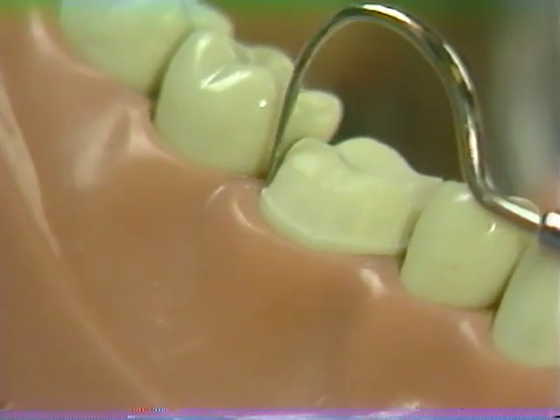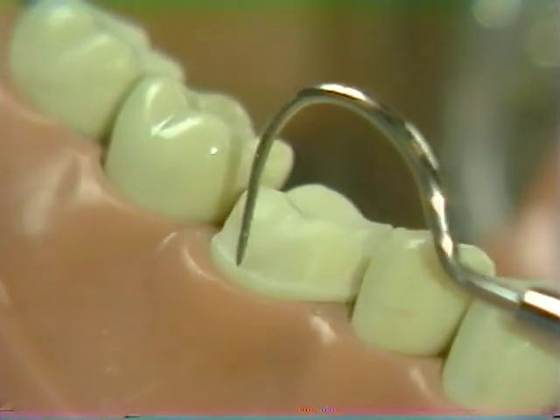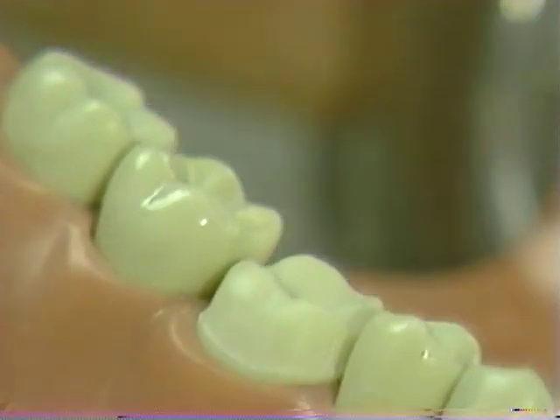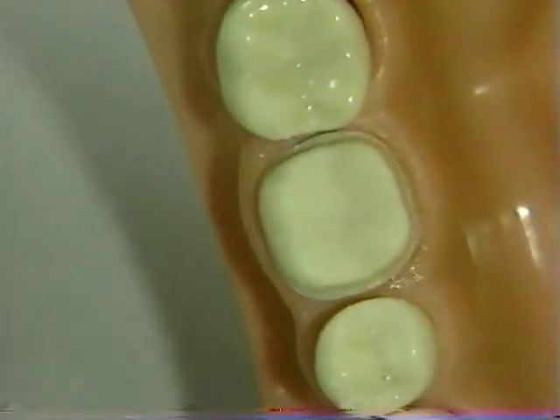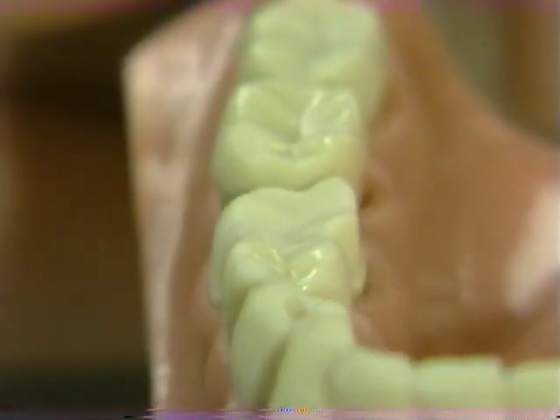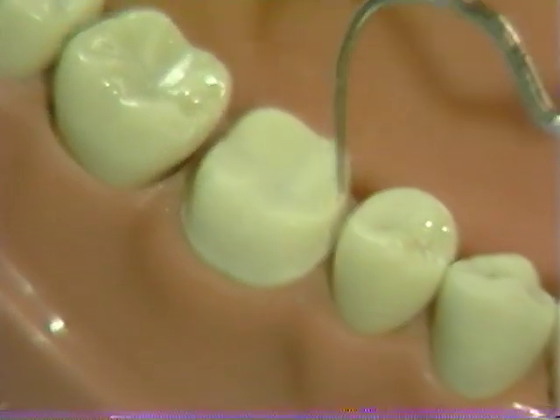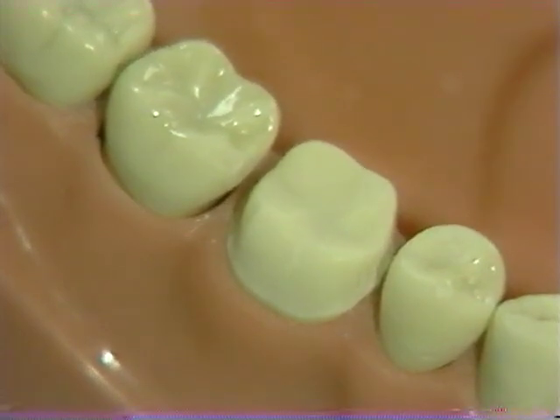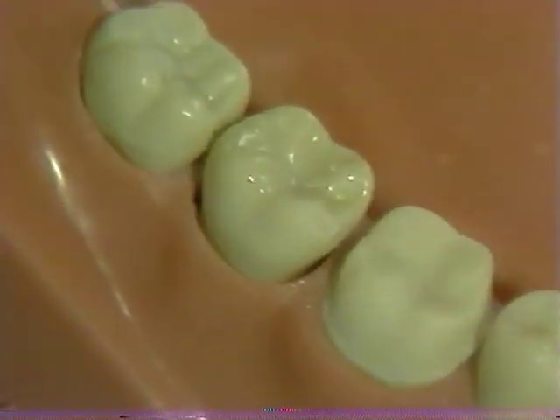Also mesiodistally and buccolingually, the chamfer should be smooth and continuous. Any irregularities are removed at this stage with the slow speed fine grit diamond. From the occlusal perspective, note that chamfer width is even circumferentially. From the proximal view, note that no undercuts remain, adequate clearance is present in the proximal marginal ridge areas, and at this stage the tooth preparation for the complete gold veneer crown has been completed.